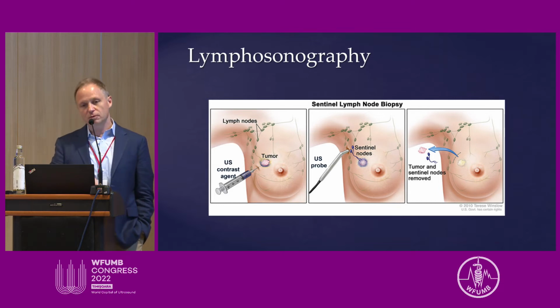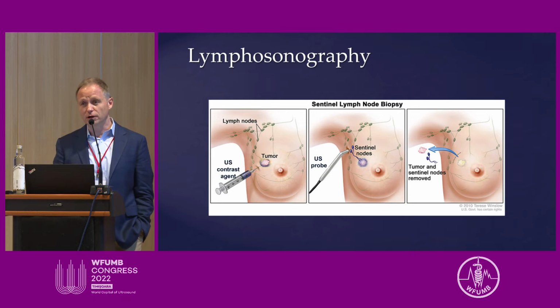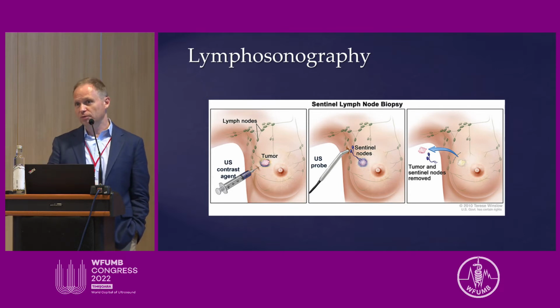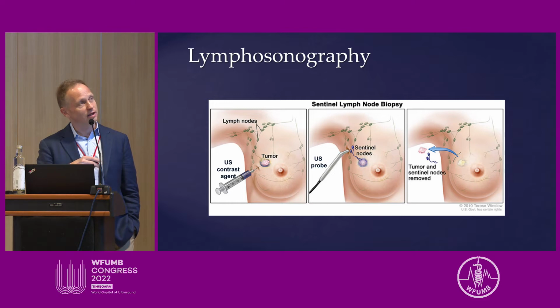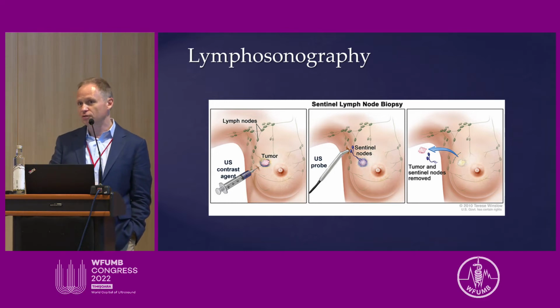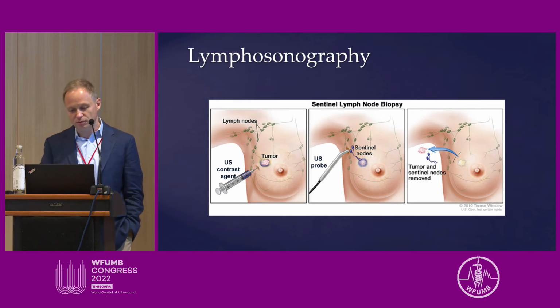The main reason why lymphatic channels are so difficult to visualize around the tumor is because they're all blocked by tumor cells. If you have a large tumor and you let it grow, there is desmoplastic reaction, there is inflammation, there is infiltrative growth of tumor. All the lymphatic channels right next to the tumor will be blocked. And if you inject your radioactive dye or your microbubbles, you're going to see absolutely nothing.